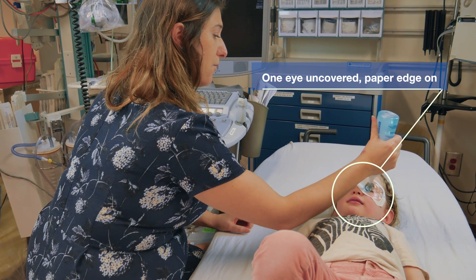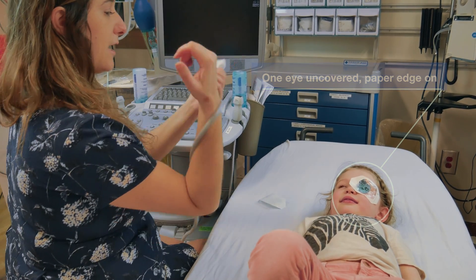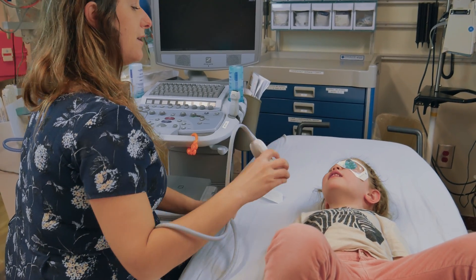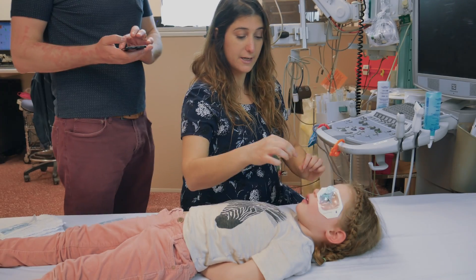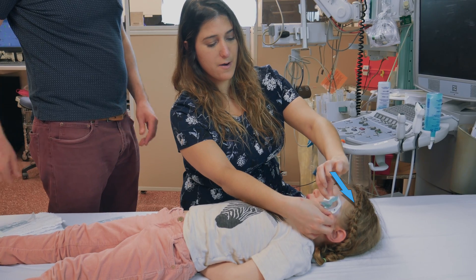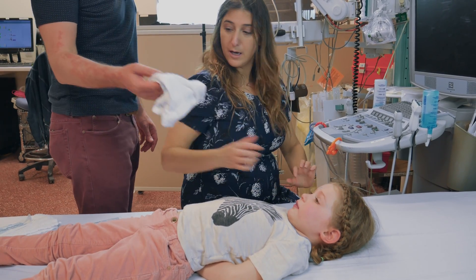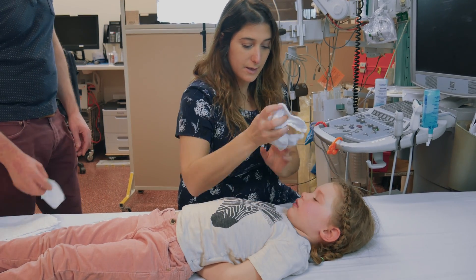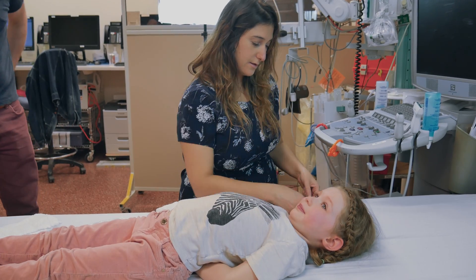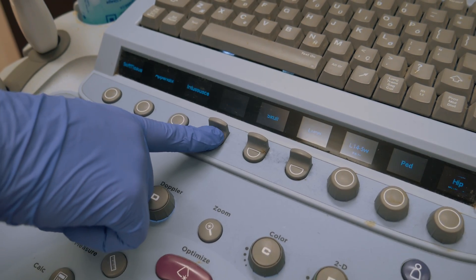To facilitate removal, leave the paper outer edge on. Common questions from families are: will the tegaderm removal be painful or remove my child's eyelashes or eyebrows? The answer is no. Removal does not cause pain, especially when removed in the direction of hair growth. Removal does not pull out hair, but it does potentially remove makeup, which may be something to mention to teenagers. You may use a new tegaderm for each eye, or you may move the tegaderm from the first eye to the second.